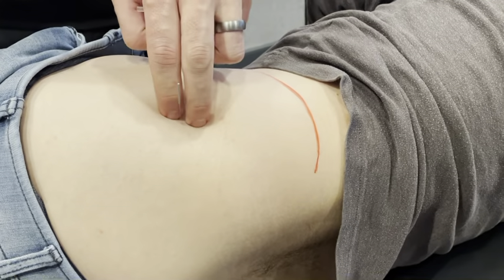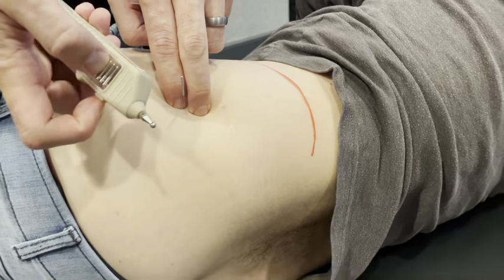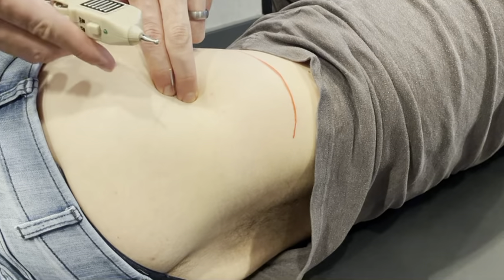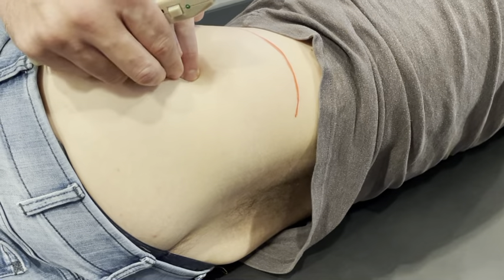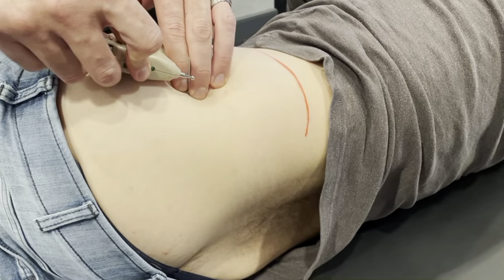Stimulate it — see, using my fingertips. My thumb is like this on the plate. Increase it a bit. I'm going to go a little deeper. There we go.